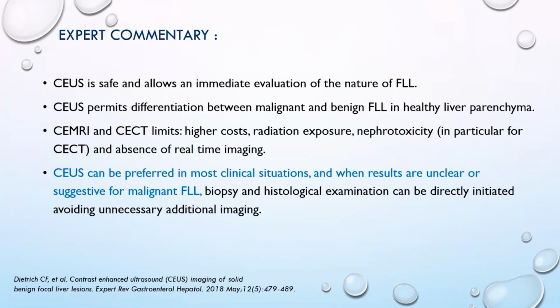All these data lead to the commentary of the experts that showed that contrast-enhanced ultrasound is a good method that allows a very rapid evaluation of the nature of the focal liver lesions. It is very good for differentiation between malignant and benign focal liver lesions in healthy liver parenchyma. And you find out that it's a little bit different when you are facing a cirrhotic liver, and again, then you are going to have the clinical information regarding this.